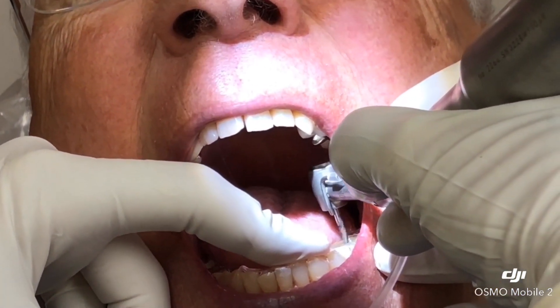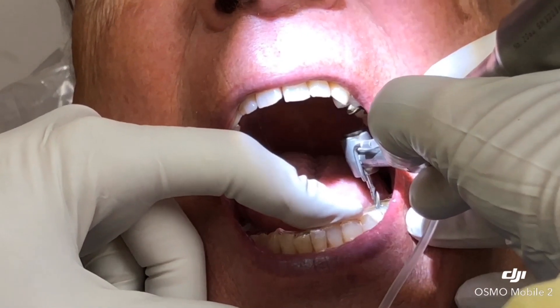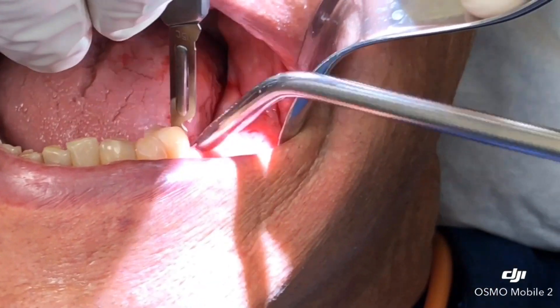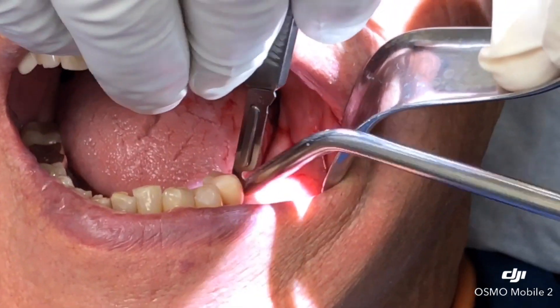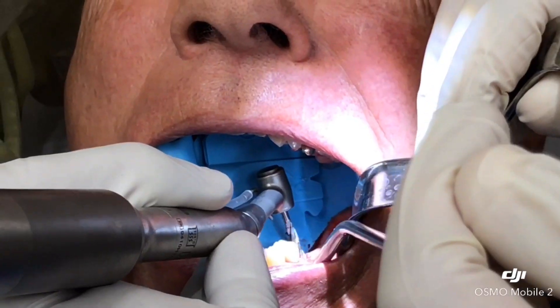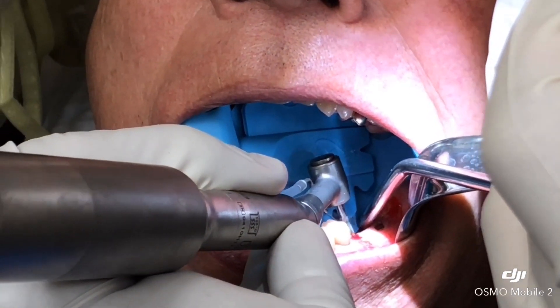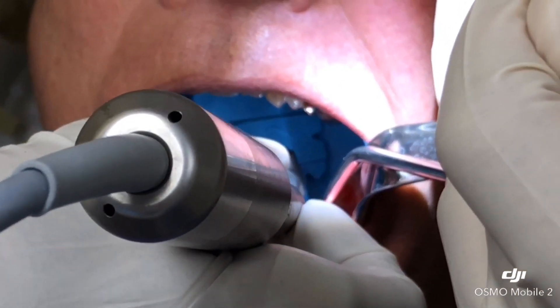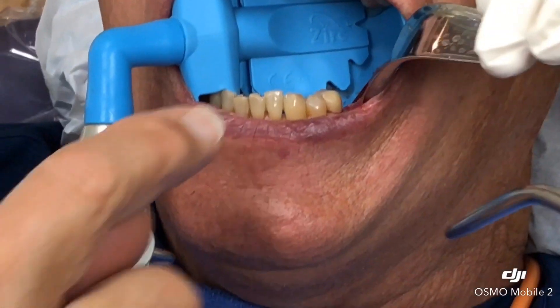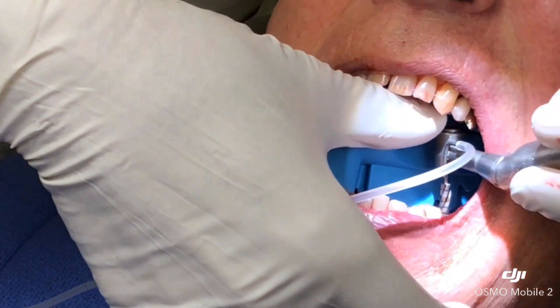This is not a true fully guided surgery. Therefore, we use the surgical template to mark the entry and to go in with the pilot burr approximately three to four millimeters, so that we can gauge the direction and position, and then we just continue without the surgical guide from then on.